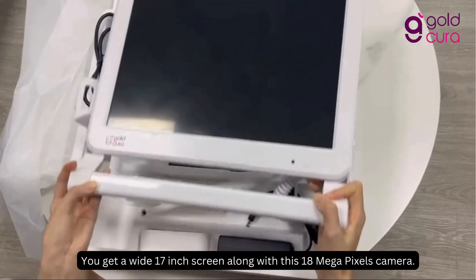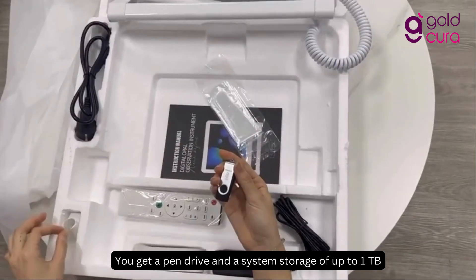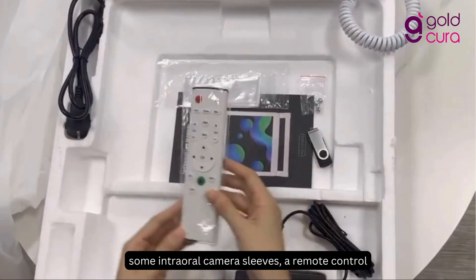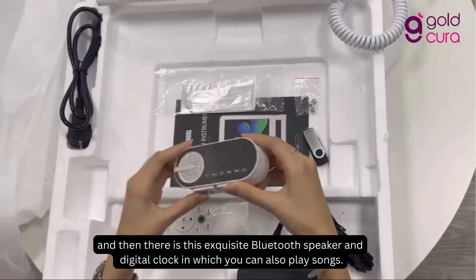You get a wide 17-inch screen along with this 18-megapixel camera. You get a pen drive and system storage of up to 1TB, some intraoral camera sleeves, a remote control, and then there is this exquisite Bluetooth speaker and digital clock in which you can also play songs.